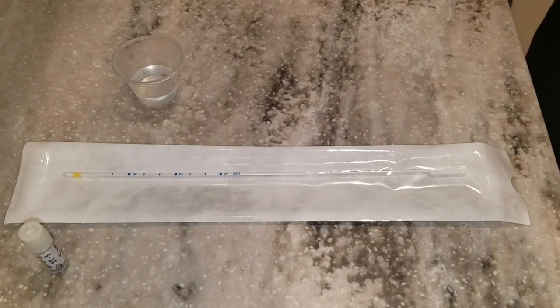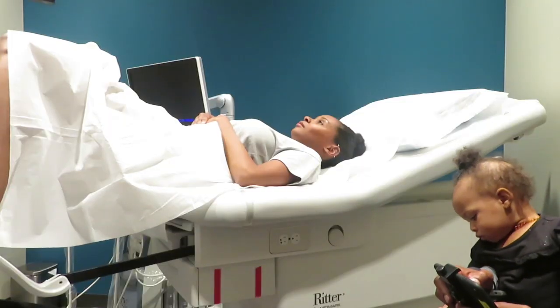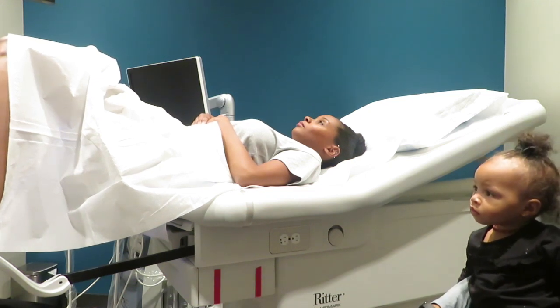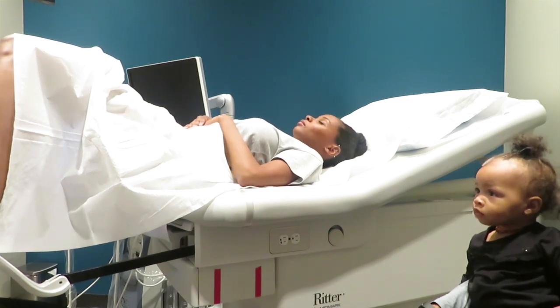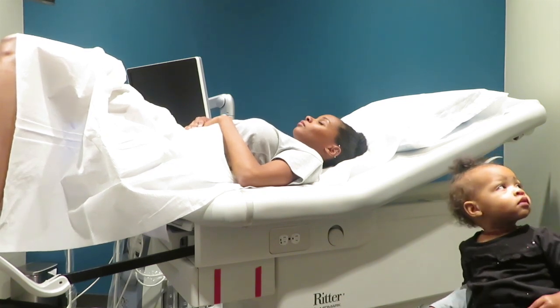Okay, I'm back. This is actually the instrument that is used to take the biopsy from the uterus for the ERA test. Even though the ERA test is fairly quick, it is very painful, and the pain is really intense. As you can see in this video, I am really just trying to breathe through the pain. The doctor usually does about a 10-second count to get the biopsy out of there, and that part is the worst part of it all.